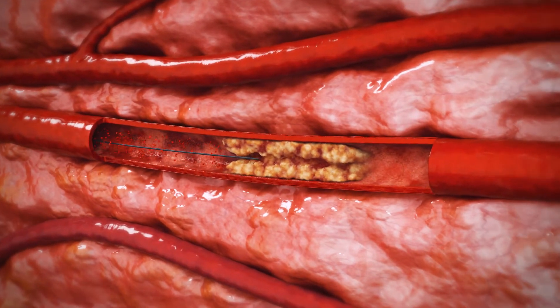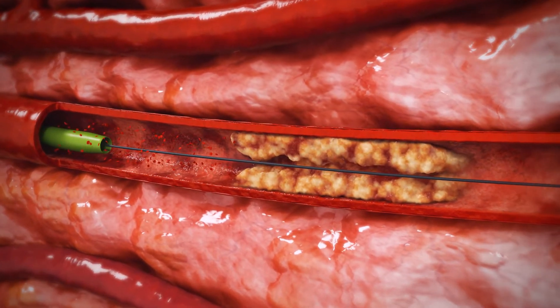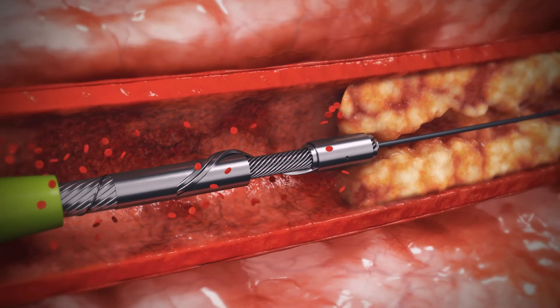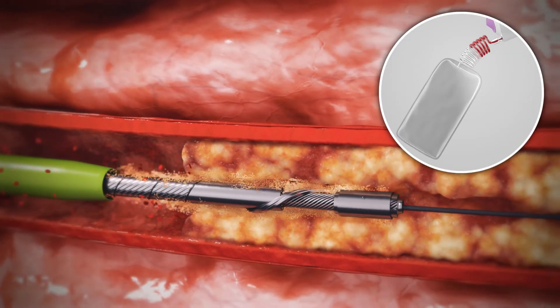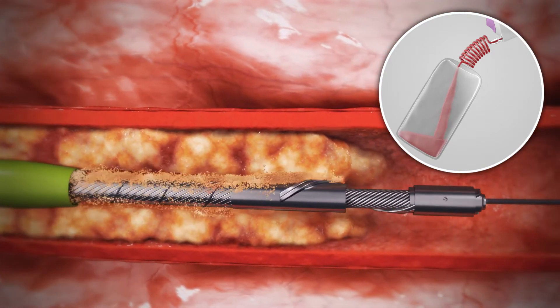With the guidewire inserted and the guiding sheath in place, after angiographic imaging to map blood flow, Bicross is introduced over the wire and into the guiding sheath. The device is advanced to the occlusion and activated while the tip is closed. It is then advanced slowly through the occlusion while debris is evacuated by simultaneous aspiration.